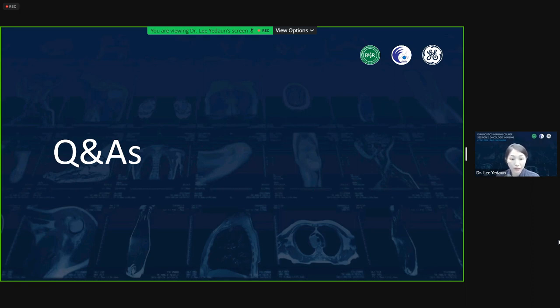and some institutions use the extracellular agent for several issues, such as arterial enhancement issues. As you know, Primovist has a problem with arterial enhancement because the patient may have respiratory difficulties during the arterial phase after injection of contrast.